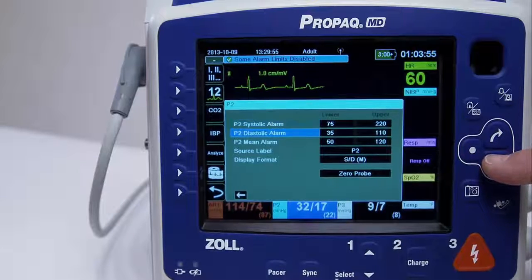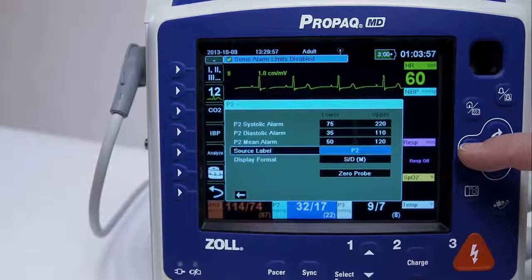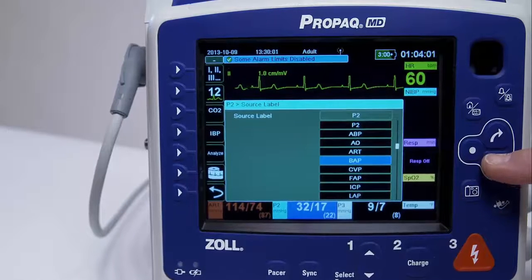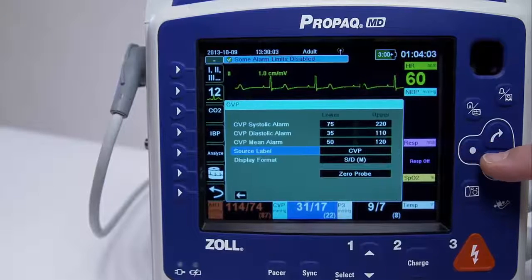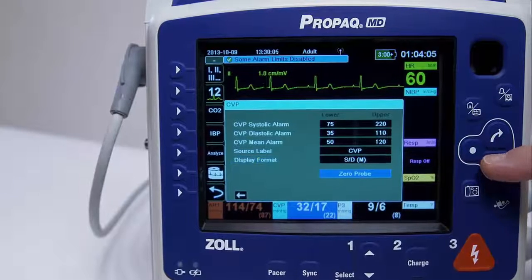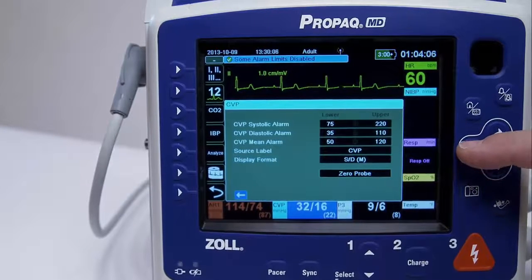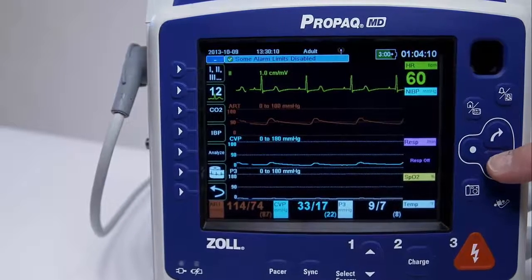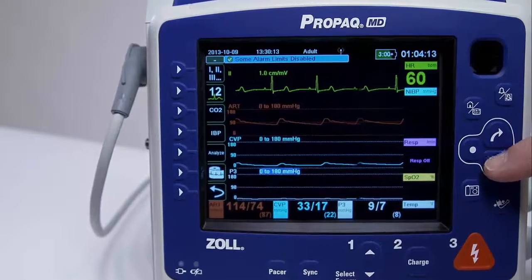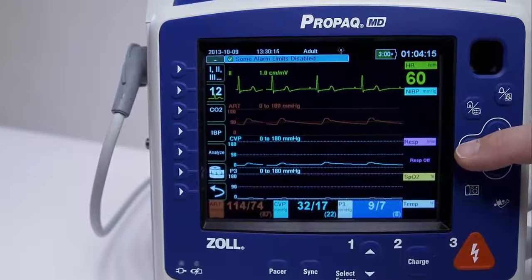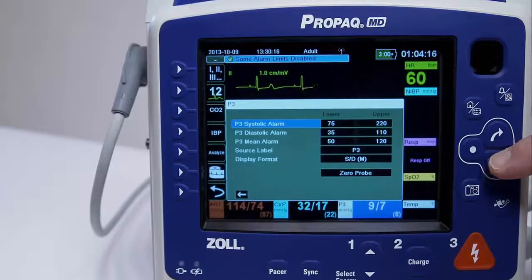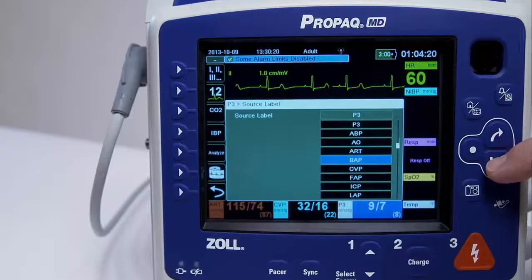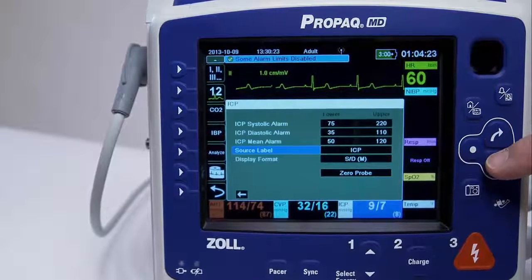After attaching and zeroing a transducer, the ProPakMD unit displays the invasive pressures — systolic, diastolic, and mean values — in the IBP channel's numeric display and, optionally, if enabled through the unit's waveform select menu, the waveform for that IBP channel. The ProPakMD unit allows you to specify a label that identifies the channel's IBP measurement and to select a display format for the numeric display. The unit displays the waveform scales after you zero the transducer.